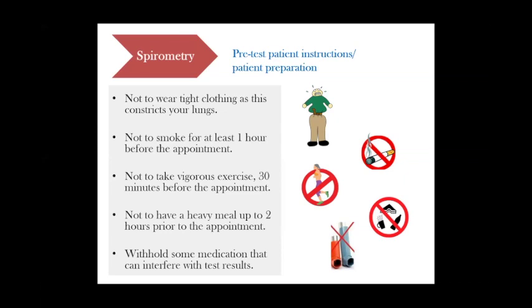Also, we should inform them to withhold any medication they are taking regularly before the appointment. So if they are on bronchodilator, we will ask them to stop taking these bronchodilators 8 hours before the appointment. If they are on corticosteroid, we will ask them to withhold this medication 12 hours from the appointment in order to get an accurate result that's representative of lung function.